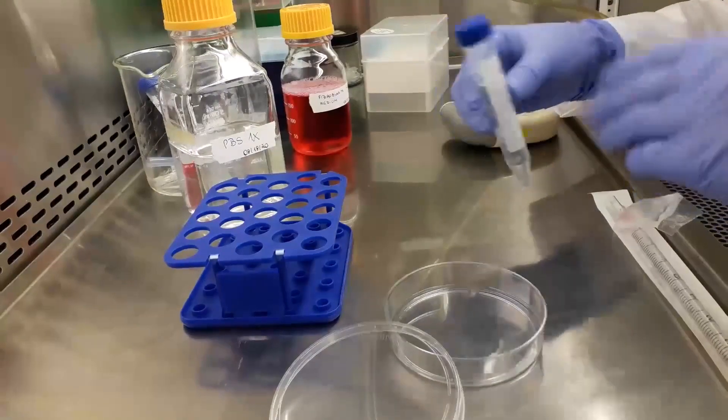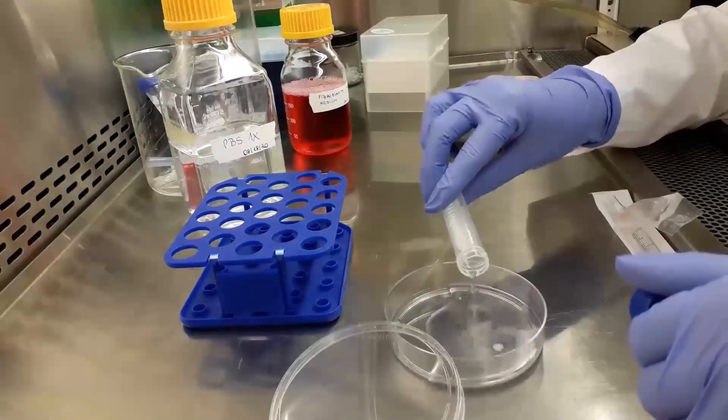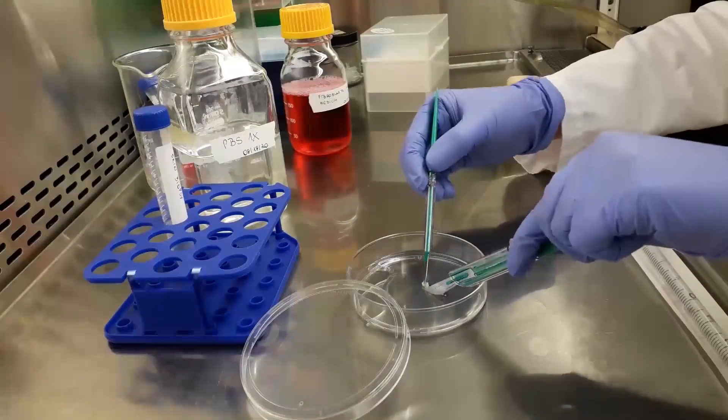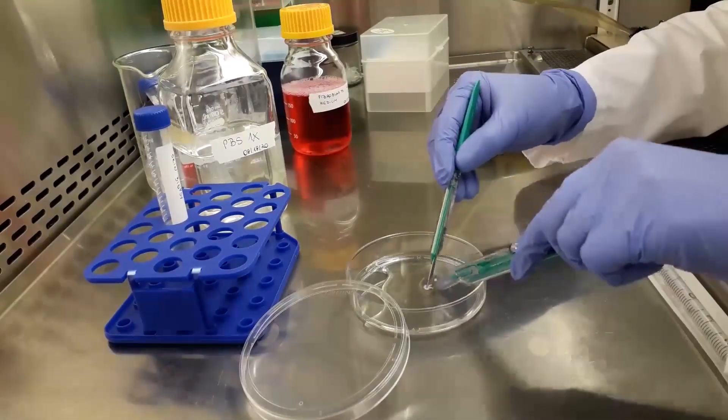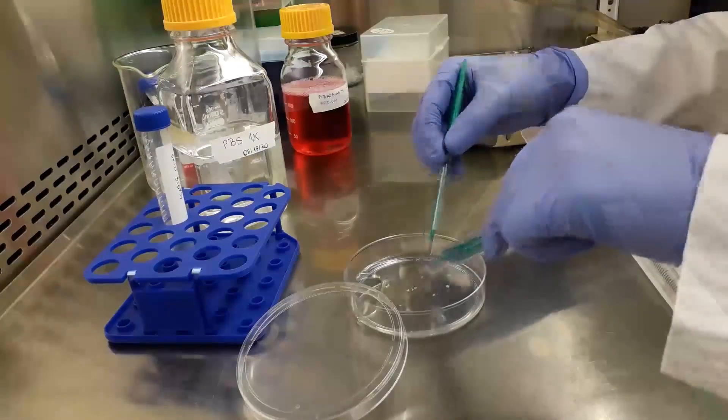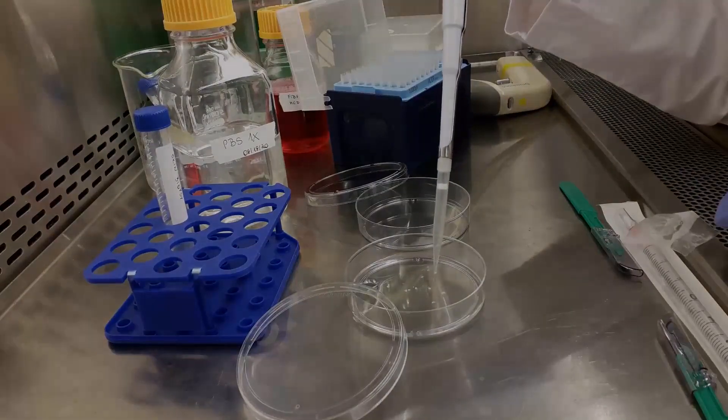Pour out the PBS and the skin biopsy onto a 10-centimeter-squared dish. Using sterile scalpels, cut the biopsy into pieces that are as small as possible. Using a pipette, transfer an individual skin piece onto a sterile 10-centimeter-squared dish.